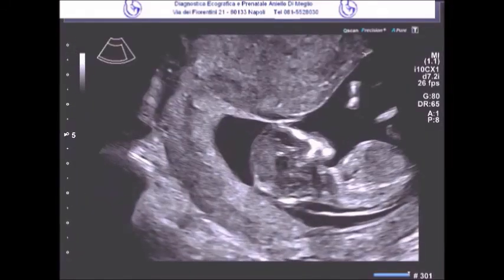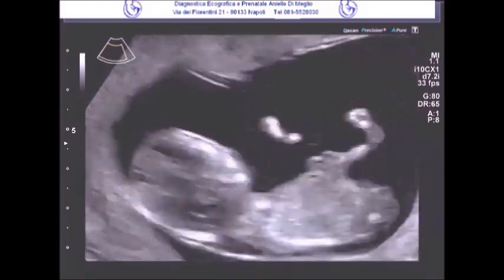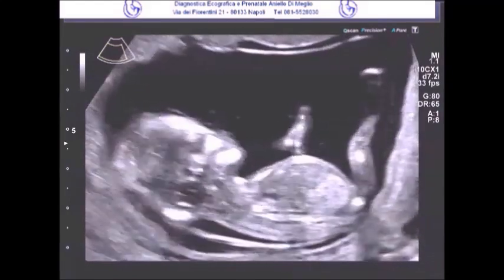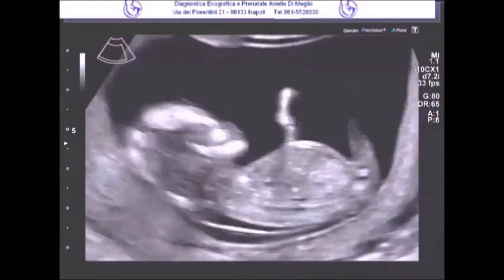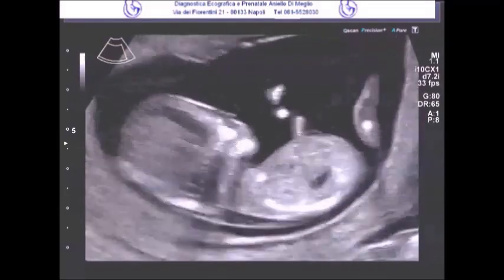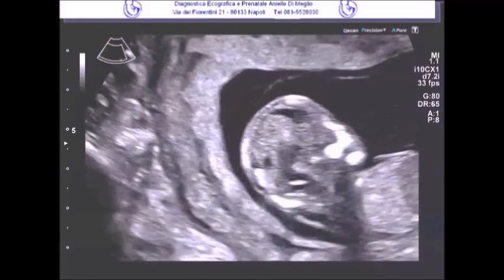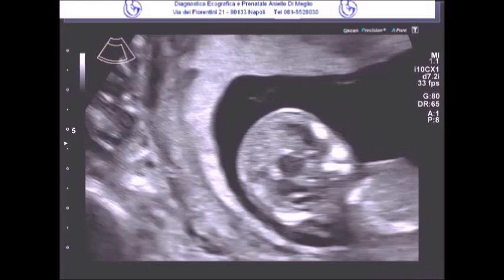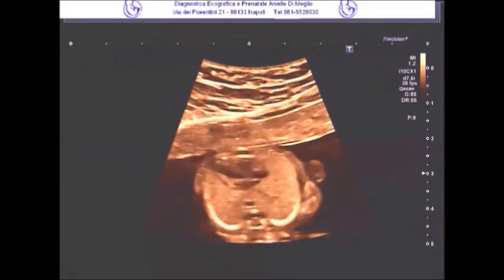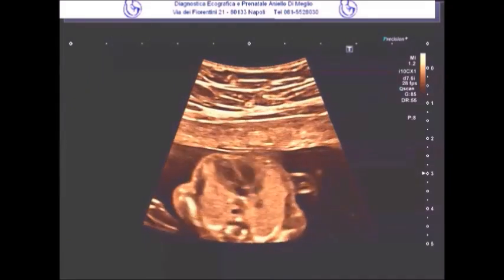Dear esteemed colleague, today we are presenting a detailed case of a patient who recently came to our clinic. She arrived to undergo the standard first trimester screening exam, during which a significant increase was clearly detected in nuchal translucency. For this reason, we recommended to the expectant mother that she undergo both a genetic test via amniocentesis and a structural ultrasound exam.